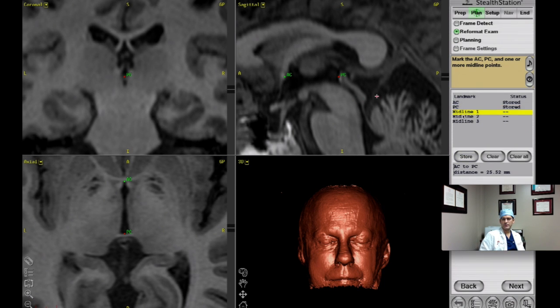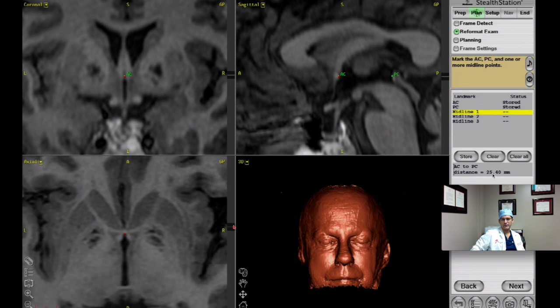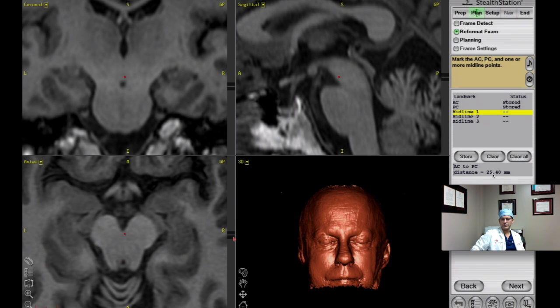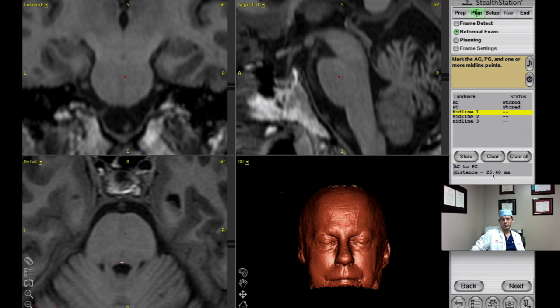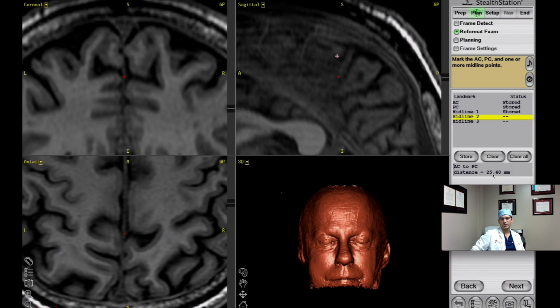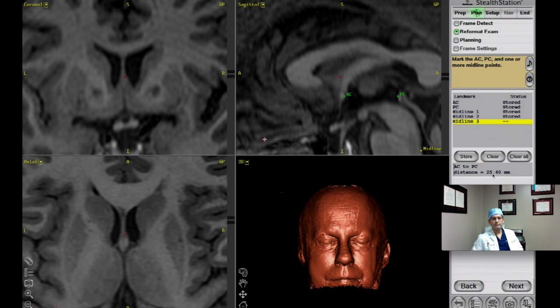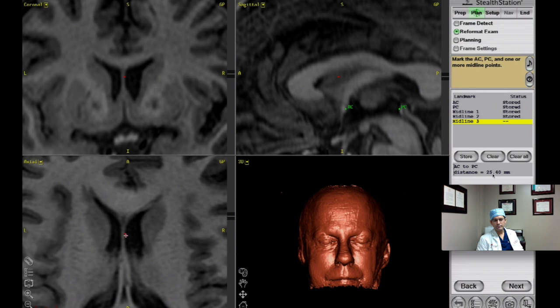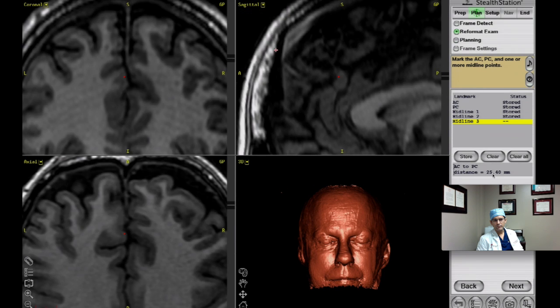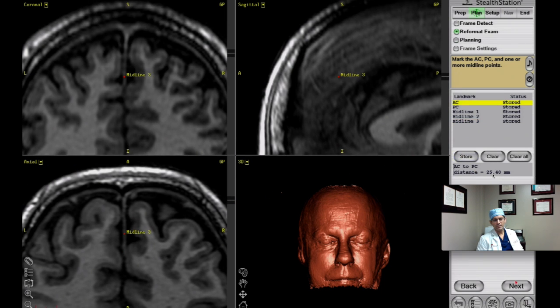I'm storing those points. Once you define the AC and PC, it tells you the distance between them — 25.52 millimeters. Once I have that initial reformatting, I may fine-tune my selection of those points. There's the floor of the fourth ventricle, and then I typically take two points in the supratentorial region along the falx. I was considering using the ventricle as a midline point, but I chose not to.